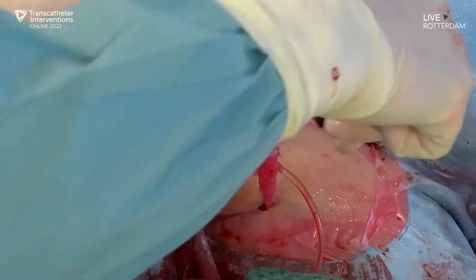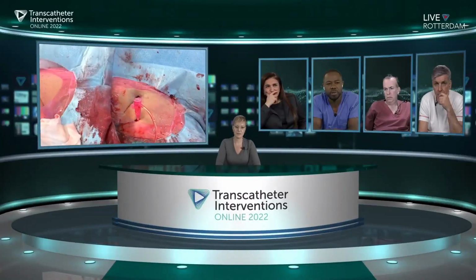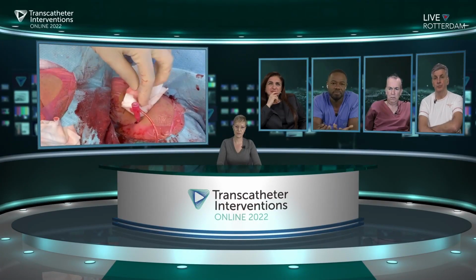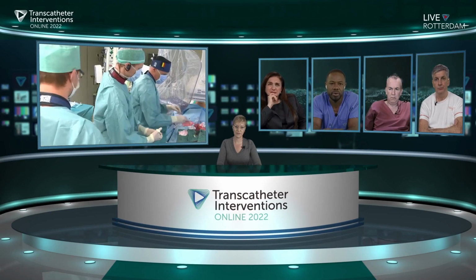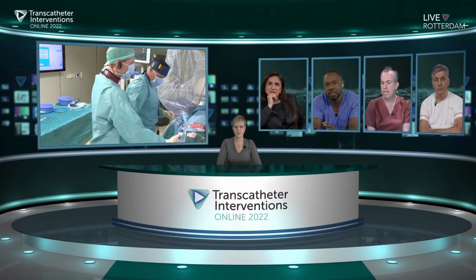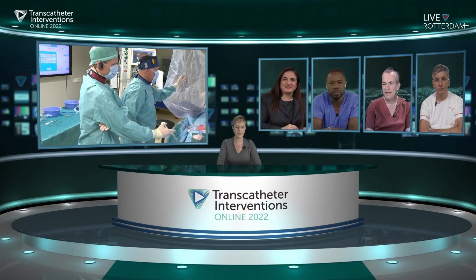I have changed my practice, moving from 2 ProGlides to only 1 ProGlide and an Angio-Seal. And particularly in these very small calcified vessels, it prevents more frequently this residual stenosis at the end of the procedure or even bleeding. So I found it to be more efficient, particularly in the challenging vasculature. 1 ProGlide and a plug on top of that. What about the Manta, Nico? You were using that device very frequently in the past. Do you think that is suitable for such vessels?